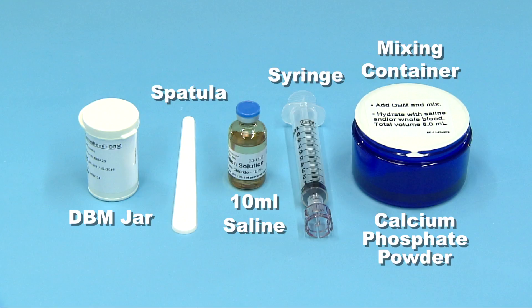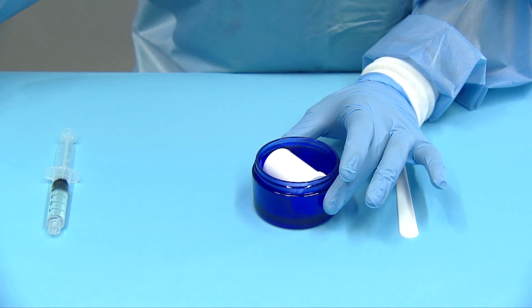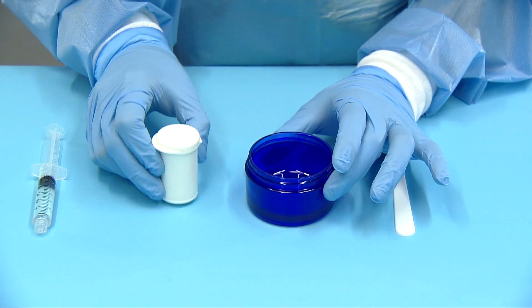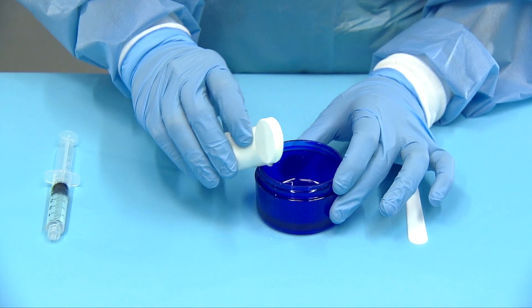Begin mixing process only when the defect is ready for implantation. Before opening, tap the calcium phosphate powder and DBM powder on a hard surface to ensure that all the powder is broken up and that the powder is not left in the container when pouring.